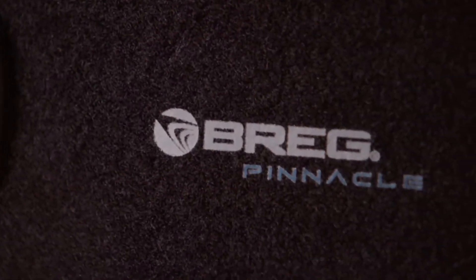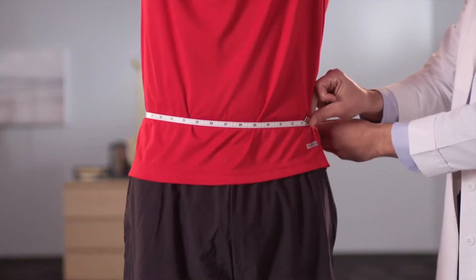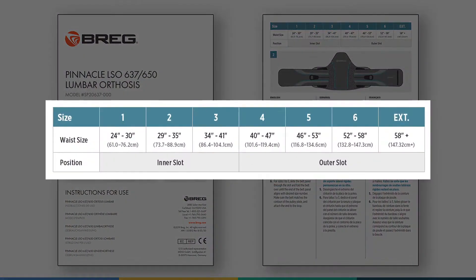To size the patient, start by measuring the patient's waist circumference at the top of the pelvis. Next, reference the instructions for use to determine which size to adjust the waist belt to. This patient falls into size 2 according to the chart.